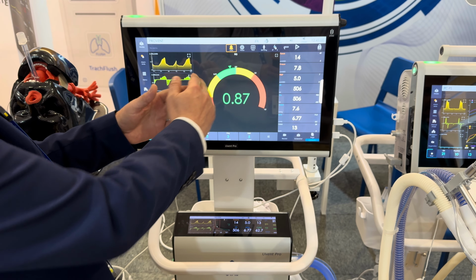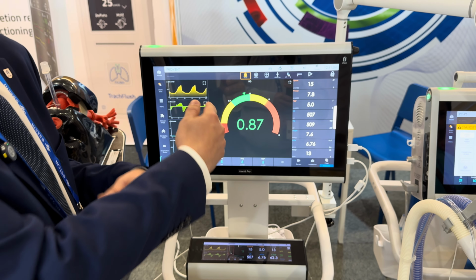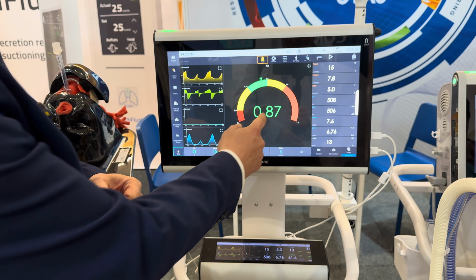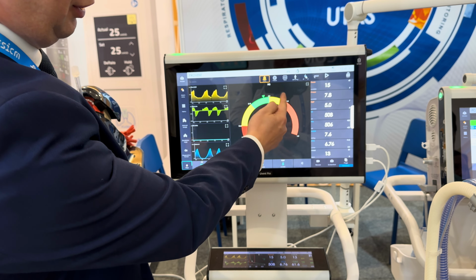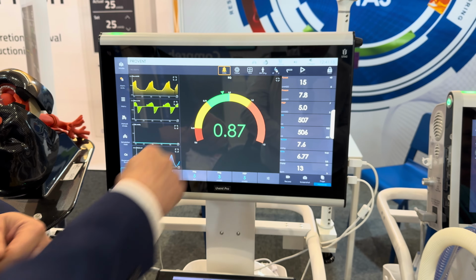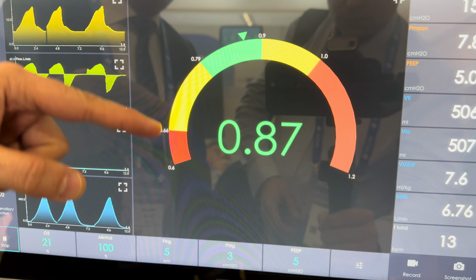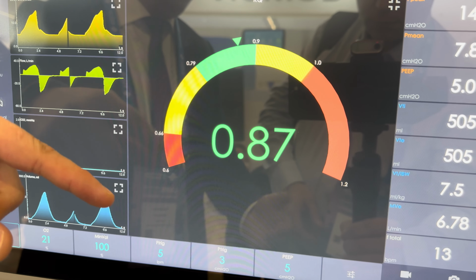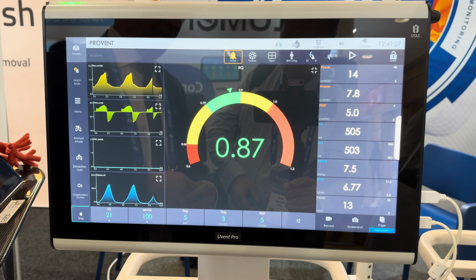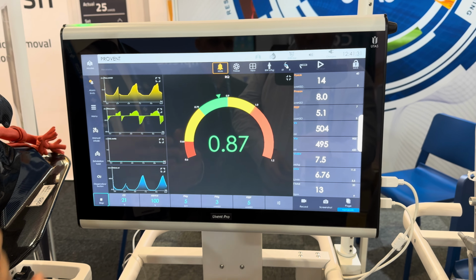If it goes down, that means that albumins are getting burned during the metabolic process, and it also reflects pathology. So here we have a zone that reflects the pathology, and the zone below 0.66 reflects that there is a problem in the measurement process and it is inaccurate, so the doctor has to apply specific parameters for that.